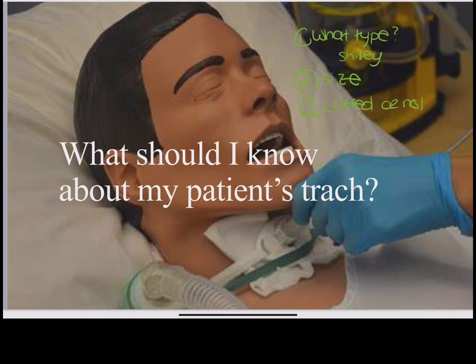Is it fenestrated or not? Does this patient have a plug? And how long, or what is the goal of using this plug in weaning off this patient? And of course, you always need to have your safety trach equipment at bedside.